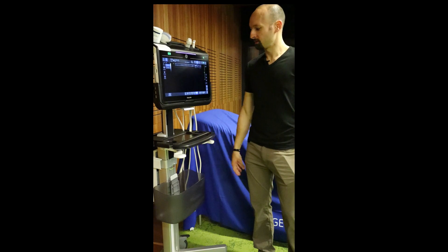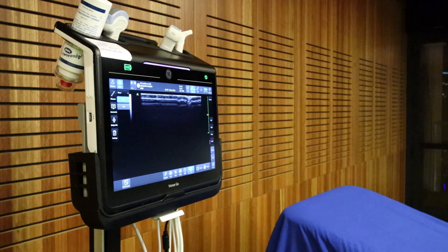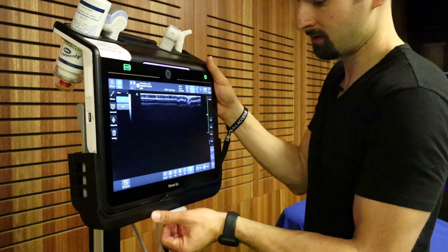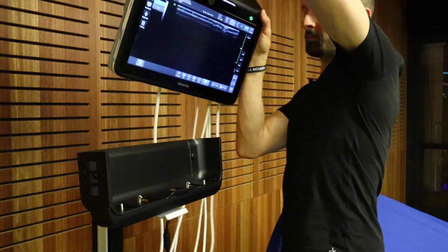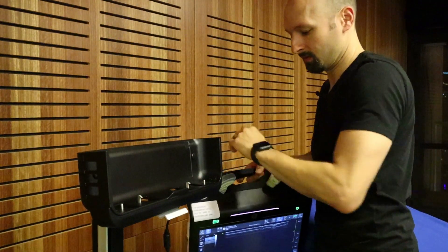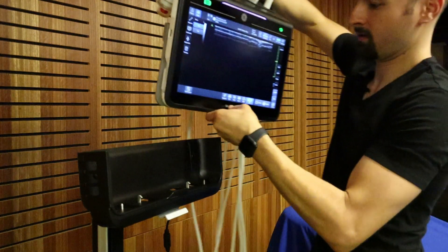It's got the little stand there, the little basket for you to put stuff in — and they showed it in the commercial — but this right here is my favorite thing. The fact that you can just pop this little tiny ultrasound machine completely off of the stand, really easy to pop off, and just throw it right back on there when you're ready. Makes it pretty versatile.